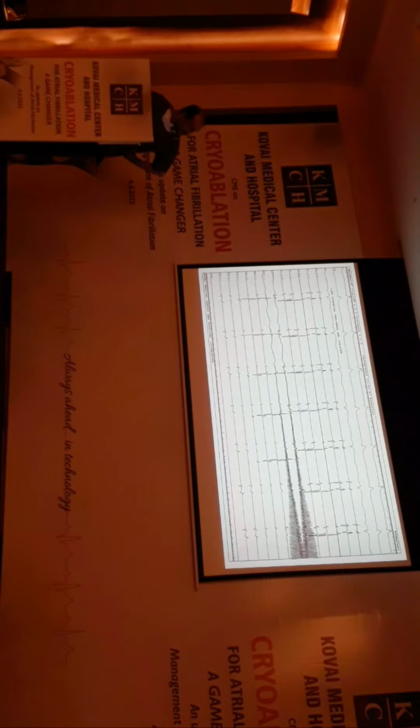So this man had predominant firing coming from the superior pulmonary veins. You can see huge pulmonary vein potentials here. This is the pre-freeze left superior pulmonary vein. So we started pacing and we started freezing here. You can already see some delay in the pulmonary vein potentials, and slowly we are getting more delay. And you can see a loss of pulmonary vein potentials here.